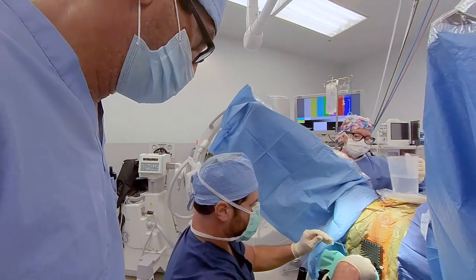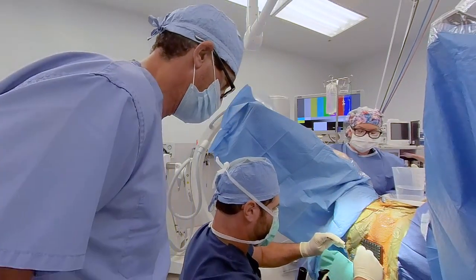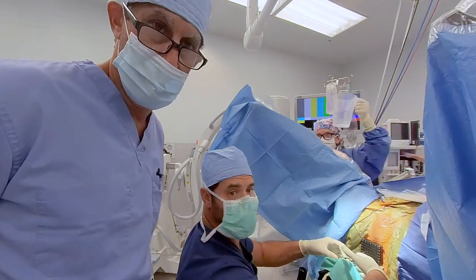So I just put in 2, 3, C and E. Maybe go down a centimeter from that? Go down to 2, C and E, and that's it. That's right, 2. Good.